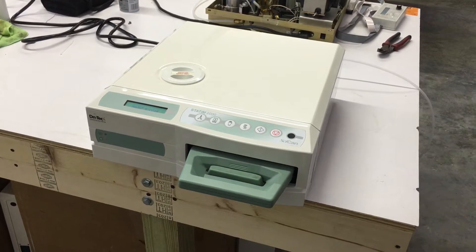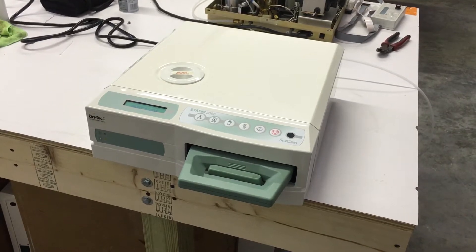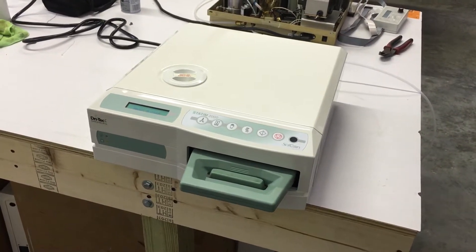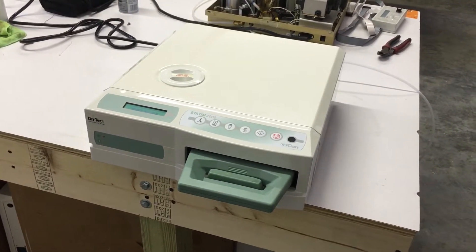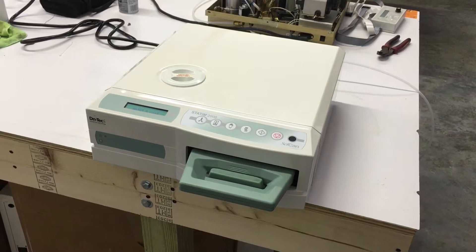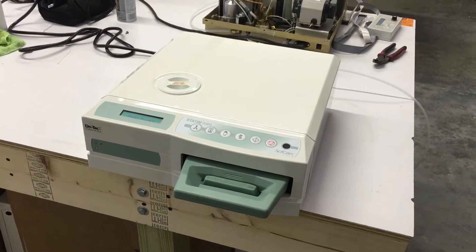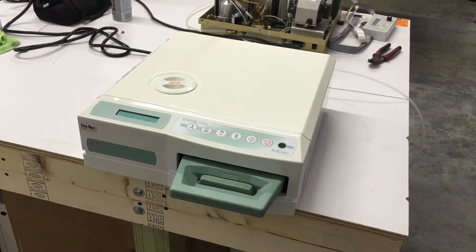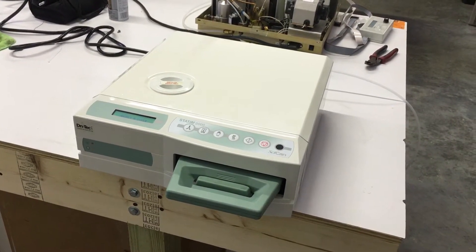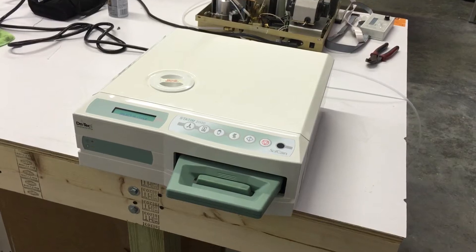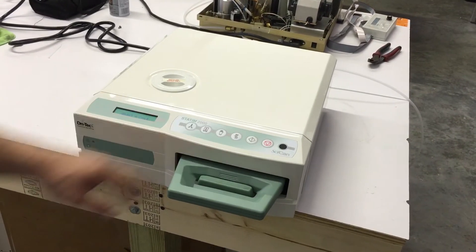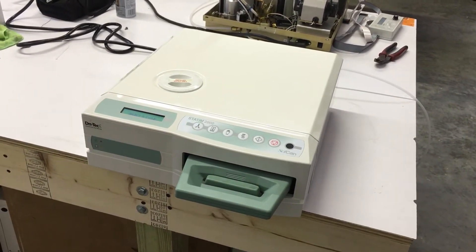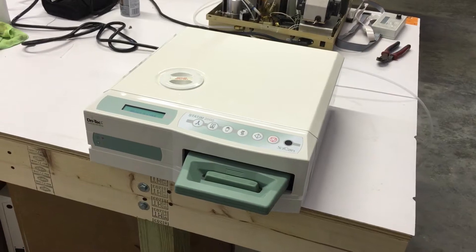Right now I'm going to show you how to take the cover off a Statham 2000 in case you want to do preventative maintenance, clean behind it, or do anything underneath the cover. Maybe you need to replace the keypad or something like that. I'm going to show you how to take the cover off.